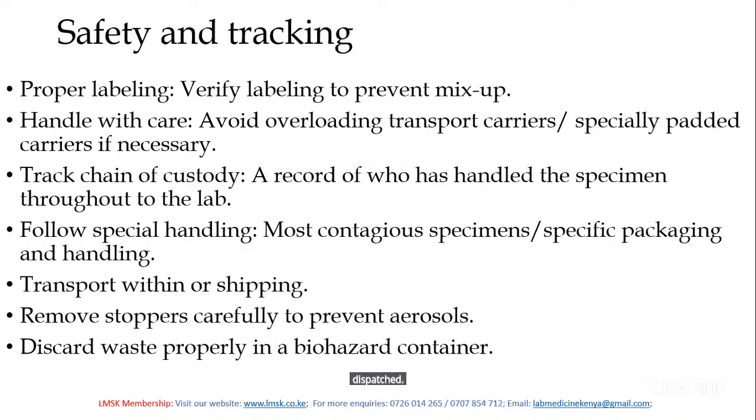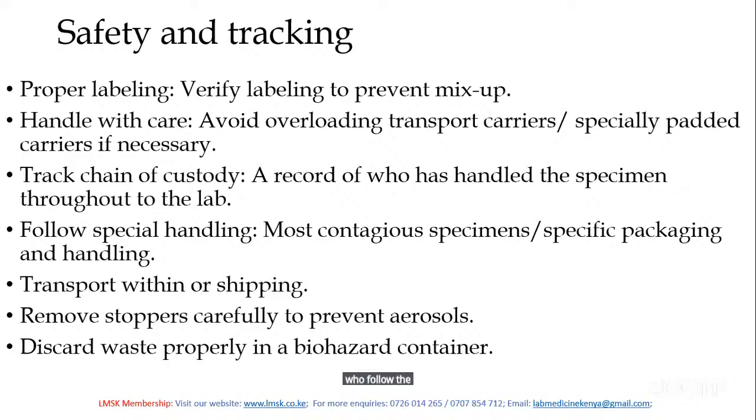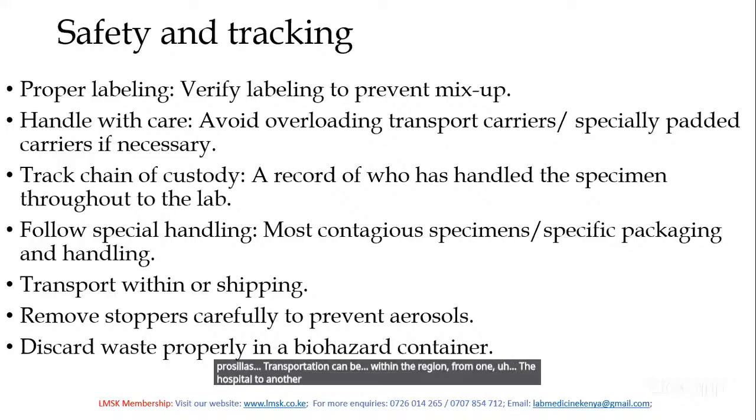Follow special handling procedure. If there are some contagious specimens, follow the recommended specific packaging procedures. Transportation can be within the region from one hospital to another, or from one country to another, that is shipping.